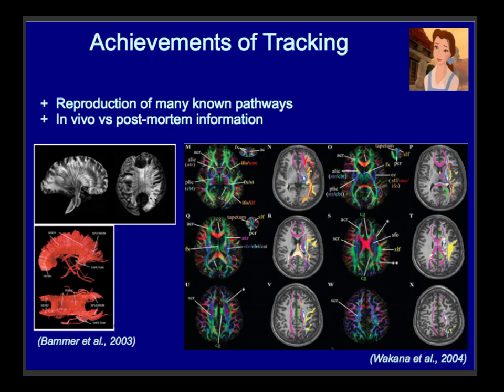That being said, a lot of serious people who know biology and care about biology and doing clinical planning, things like that for surgeries, do find tractography useful in some sense, in that it does consistently reproduce a lot of major known pathways. And this can be useful because basically we don't have a good alternative for parcellating the white matter skeleton.